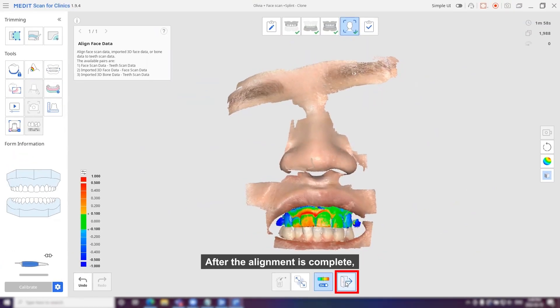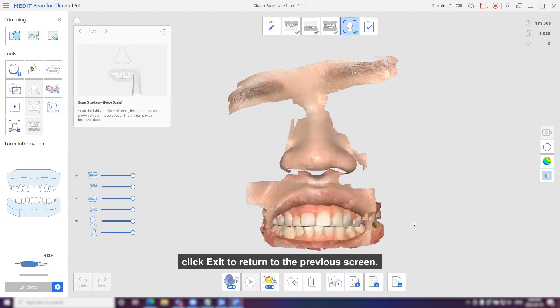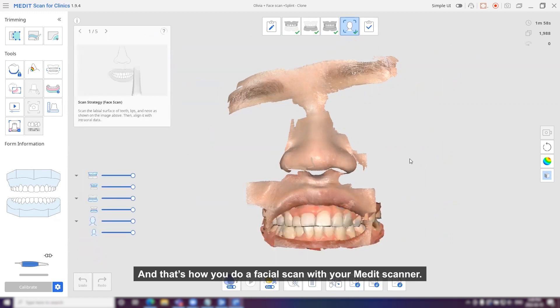After the alignment is complete, click exit to return to the previous screen. And that's how you do a facial scan with your MediScanner.